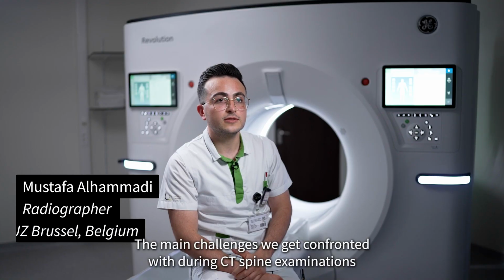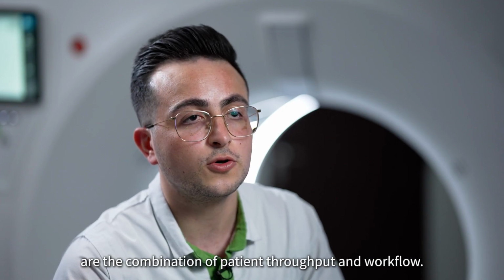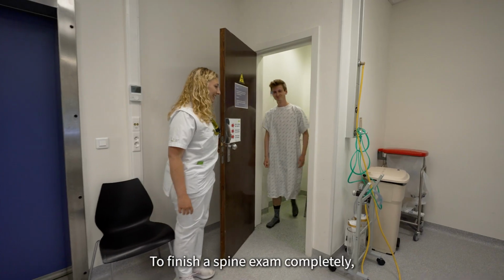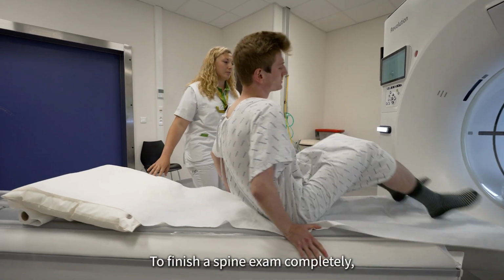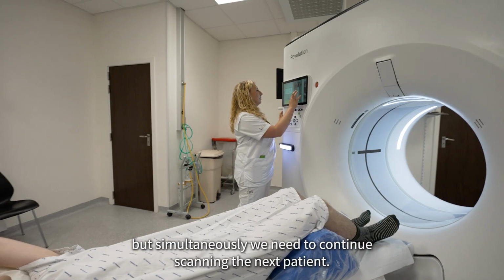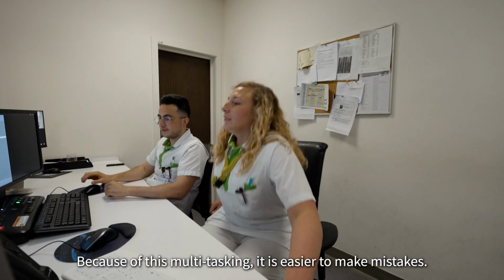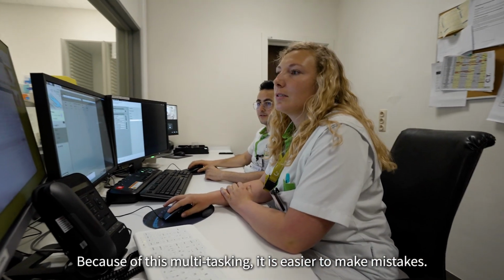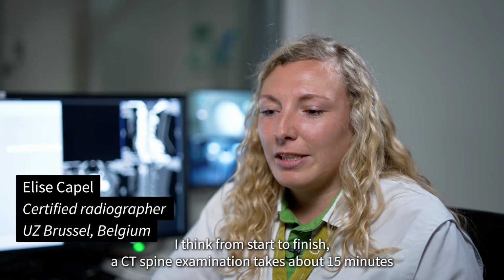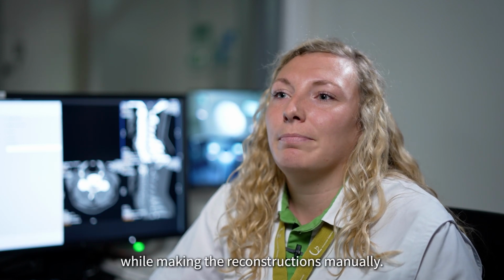The main challenges we get confronted with during CT spine examinations are the combination of patient throughput and workflow. To finish a spine exam completely, reconstructions need to be made, but simultaneously we need to continue scanning the next patient. Because of this multitasking, it is easier to make mistakes. I think from start to finish, a CT spine examination takes about 15 minutes while making the reconstructions manually.